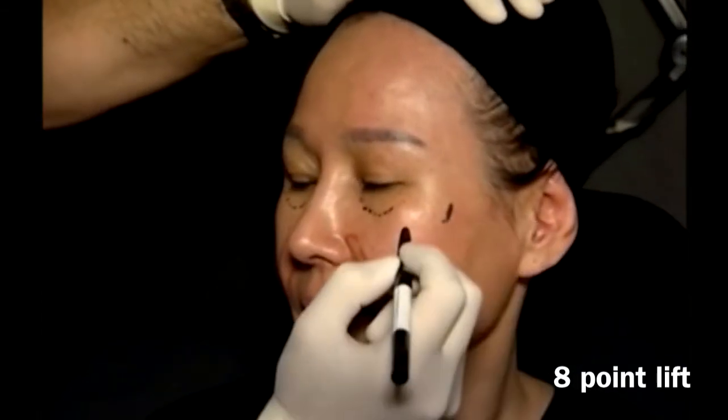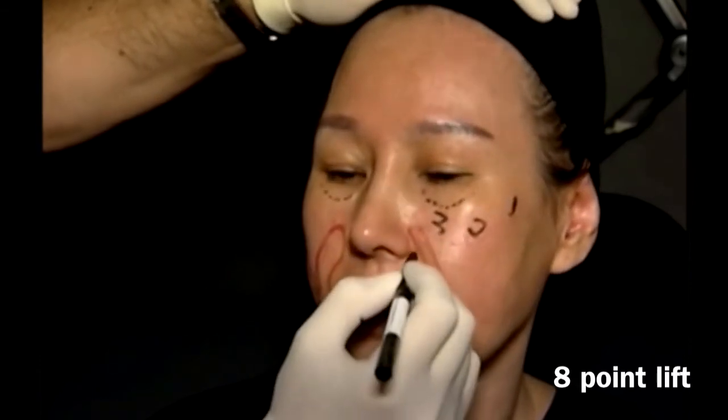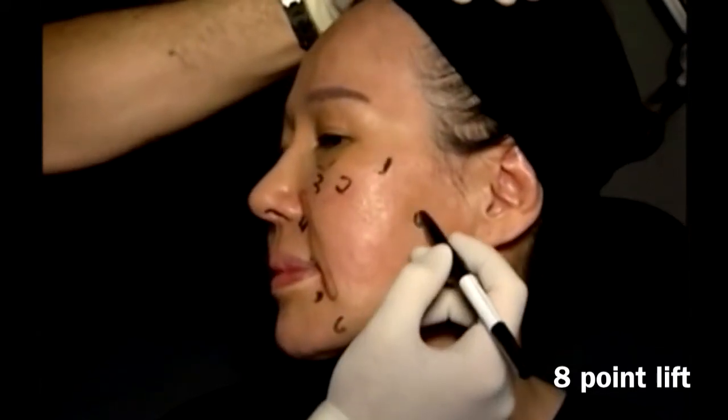Mark point number 1, 2, 3, 4, 5, 6, 7, and 8.